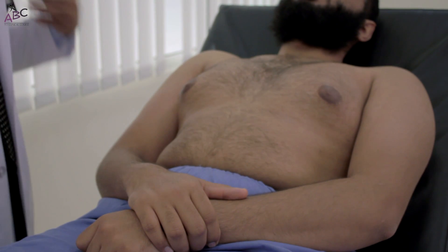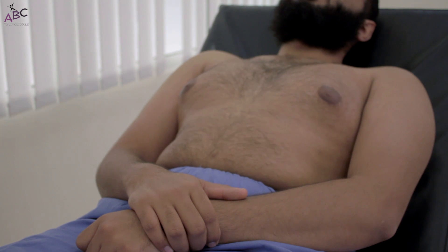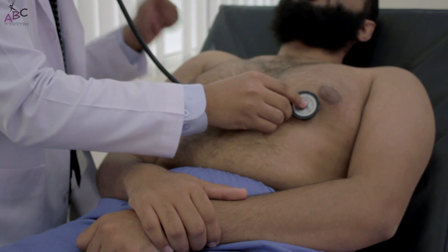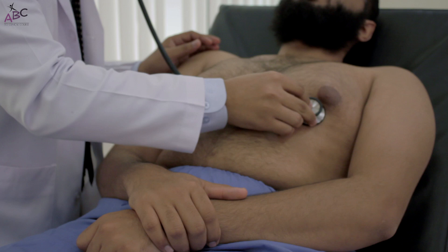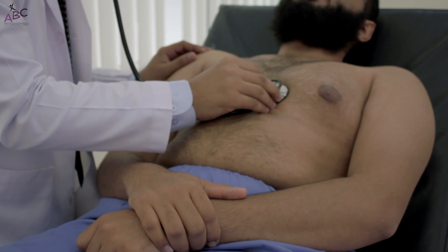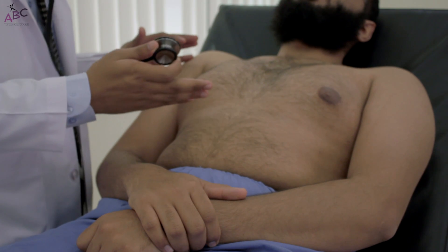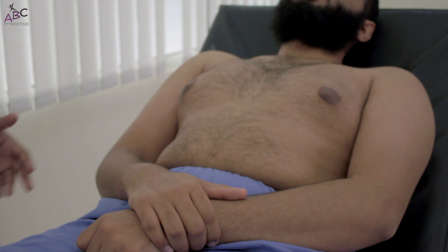Now we do auscultation. We start with the bell at the mitral area with light pressure to listen for S3 and the mitral stenosis murmur. Then we switch to the diaphragm and listen at the mitral area, then the tricuspid area, then the pulmonary, and finally the aortic area. We can comment: normal S1 and S2, no extra heart sounds S3 or S4, and no audible murmur.